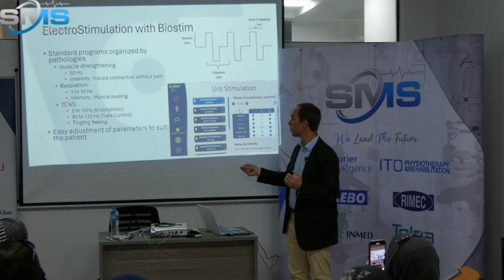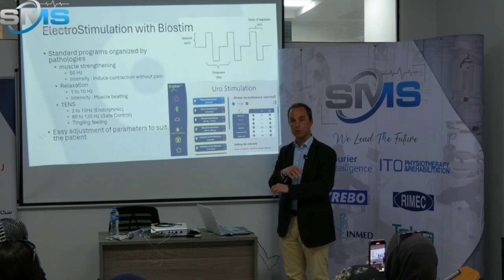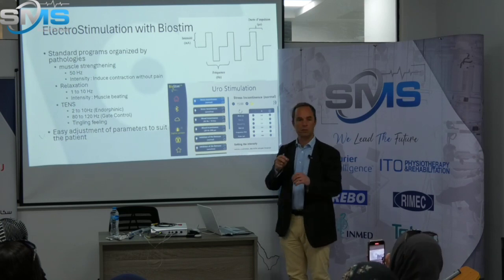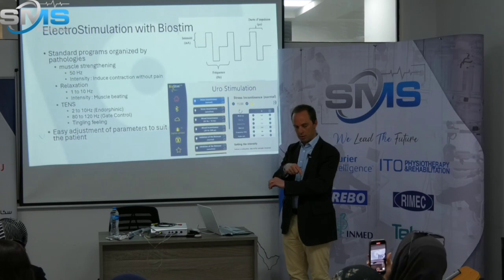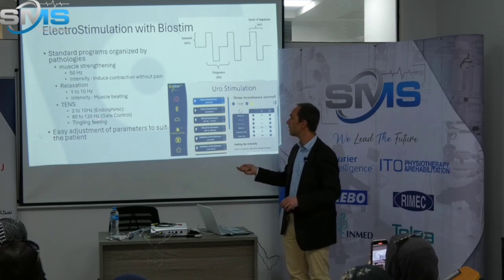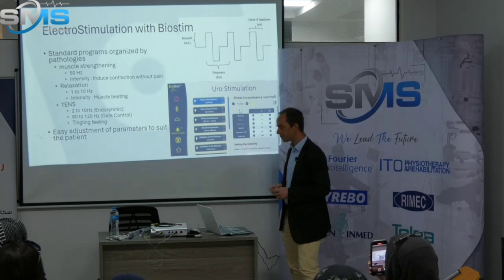And last point, when you're doing tense currents, it's counterproductive to have a contraction. You just need to feel the current, because with this kind of current, you don't work on muscles, but on nerves. So you must not activate the muscles, you must just be effective on nerves. That's why you must just have a tingling feeling, just going through. That's when these currents are effective.